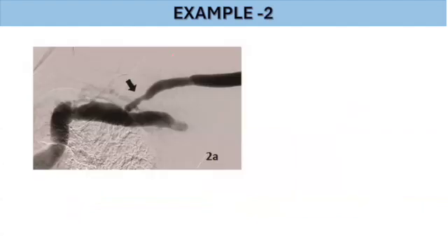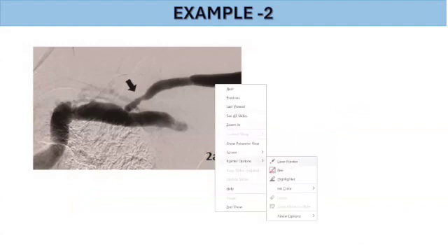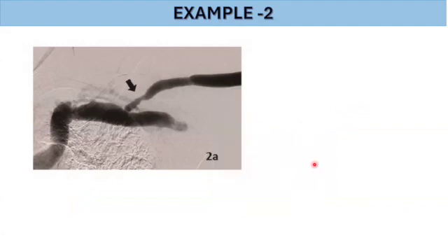Coming to example 2, this is a cephalic arch stenosis. In this cephalic arch stenosis, suppose you have entered through a fistula and passed the guide wire, and the guide wire is not passing. So this is the region in which guide wire should pass, but suppose guide wire is not passing and you need to support the guide wire here. So which catheter you will advance till here? This would be an angled catheter. As we use, if you are working somewhere where Bernstein is available, you can use Bernstein or Kumpe. If you're working under cardiology, you can use a JR catheter, Judkin's right catheter.